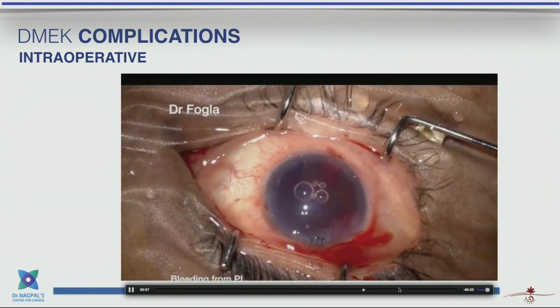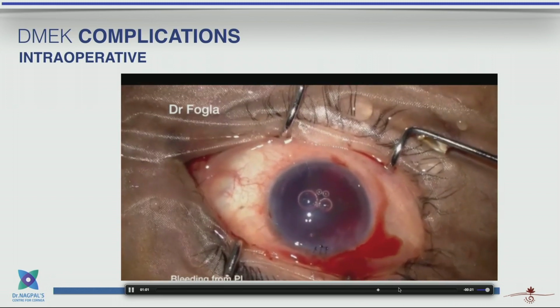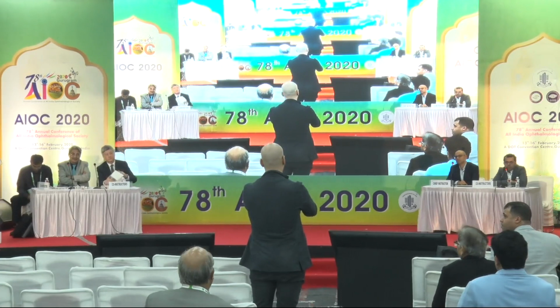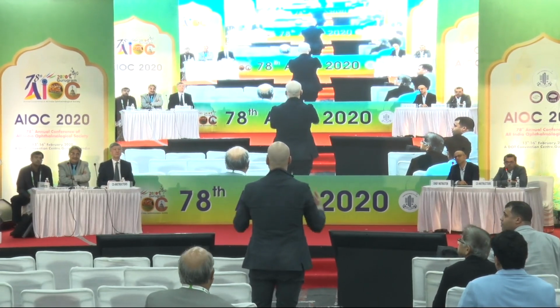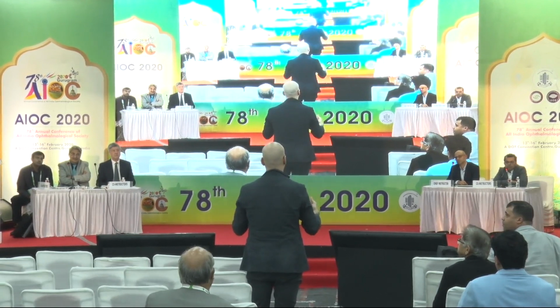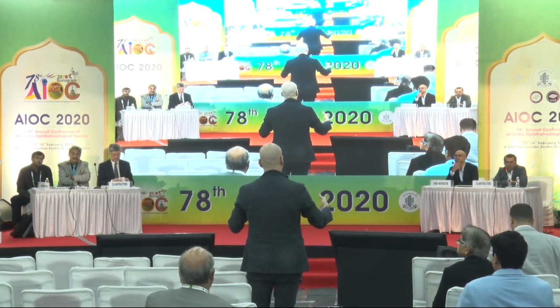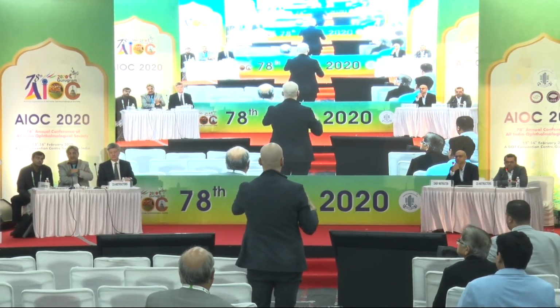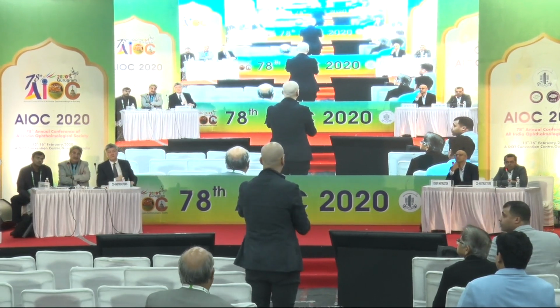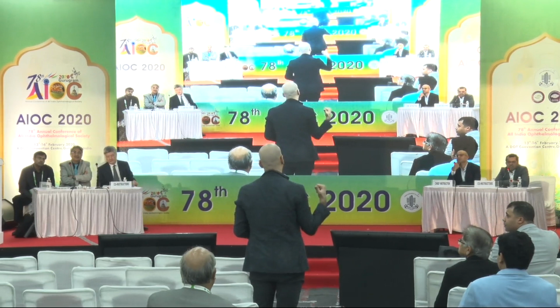So this is a lot of blood which will definitely cause problems, but for DMEK, in the main incision, if you go past the main incision and past the pupil, you won't have this backlash. And if the anterior chamber is full with pressure, then you can just take a spatula and press on the paracentesis, and then you can inject it more safely and go out while you're injecting it, and then you have a really low chance of the graft coming back to you.